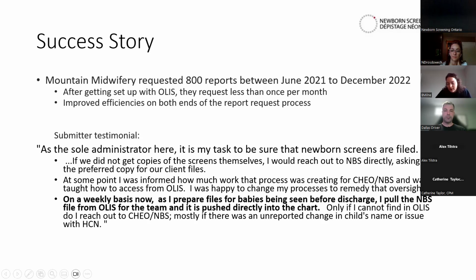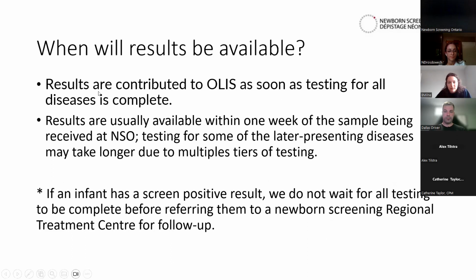So it does make a very efficient process when we can all work together to retrieve requests as quick as possible. So I'm going to be handing it over to Nadine now, and I'll mute myself.